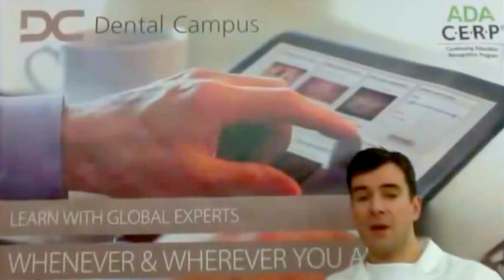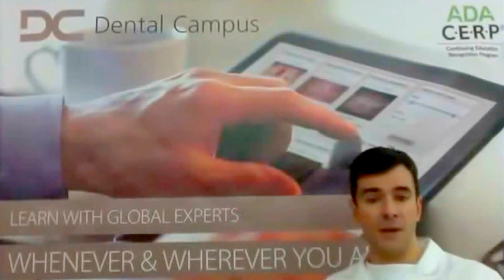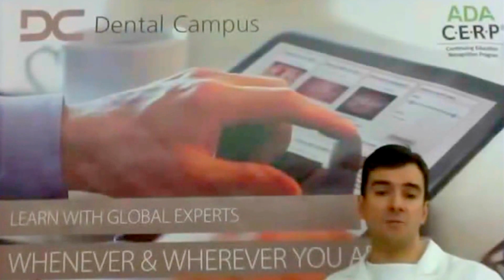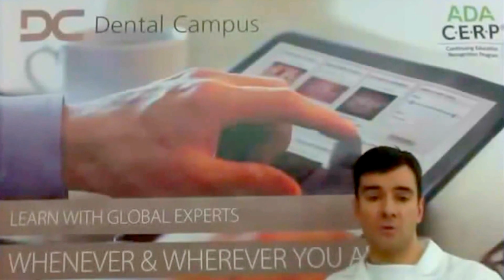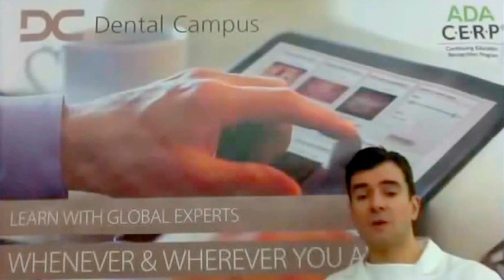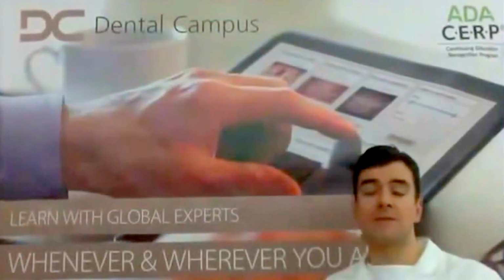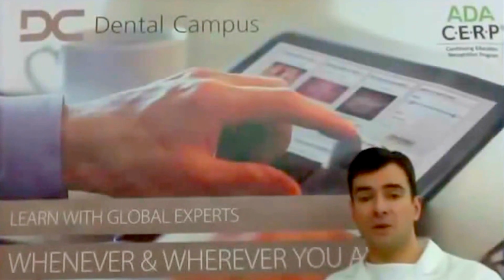And the biggest advantage of segmentation is prosthetic in nature. In case of prosthetic complications, and we have to be honest, the chippings, in particular the chippings of the metal ceramic and also the full ceramic, are quite a frequent problem. By having a small segment, it's much easier to manage the repair of the fractured ceramic.